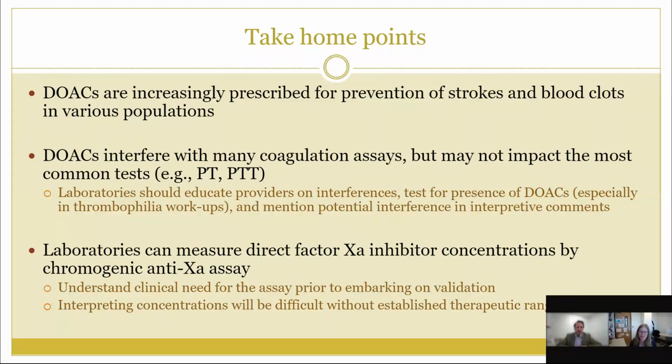I think that all goes into that calculus. For us at our institution, we still do heparin monitoring via PTT. And so we're less affected by a lot of this, and our PTT reading, especially to apixaban, is not that affected by it. So in some ways, that helps a little bit because they can use their PTT based nomograms, especially in the presence of apixaban, and not really be worried about apixaban interfering with that.